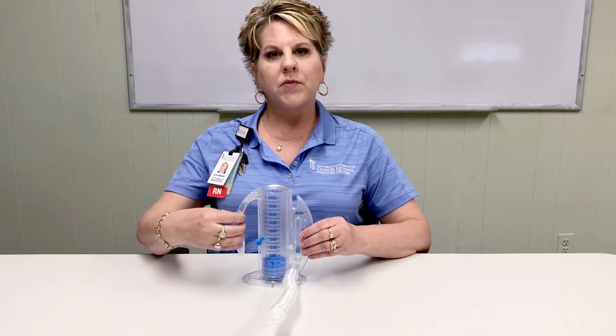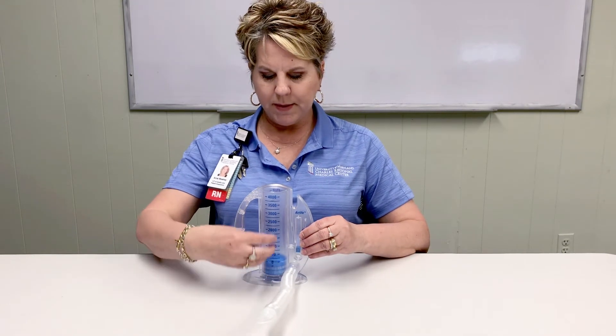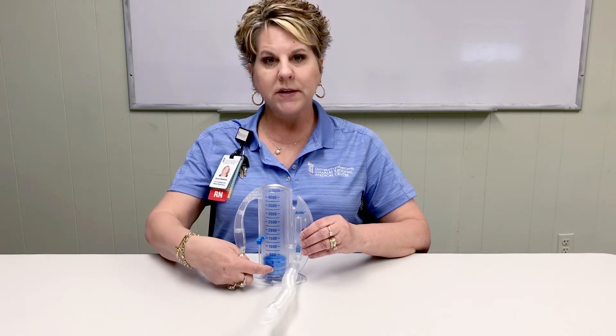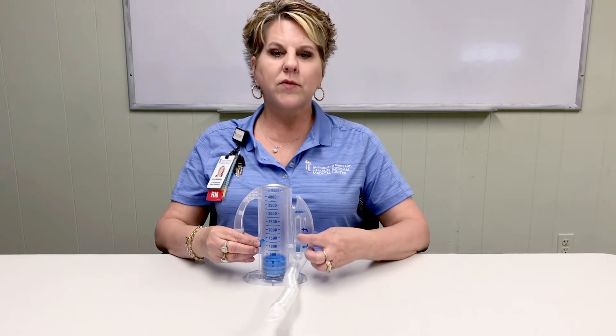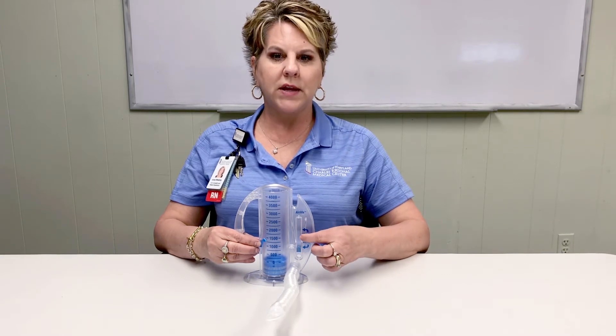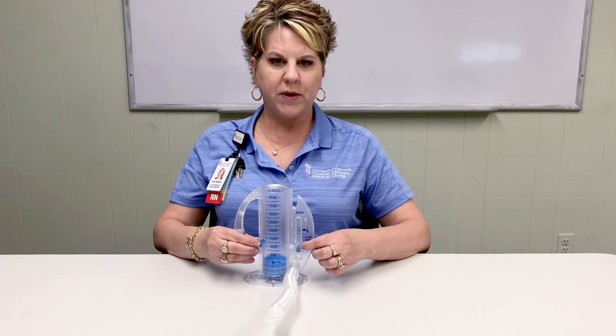The tool is made up of the handle. This is the main chamber with the blue piston inside. You have the goal marker. And you have the flow indicator, which will guide you to inhale slowly through the mouthpiece.